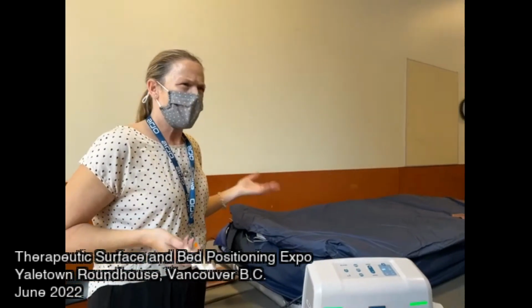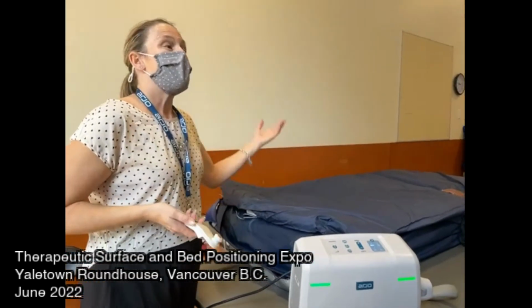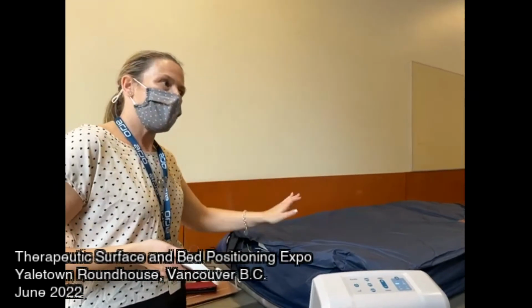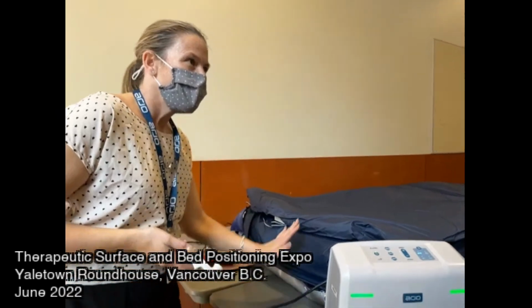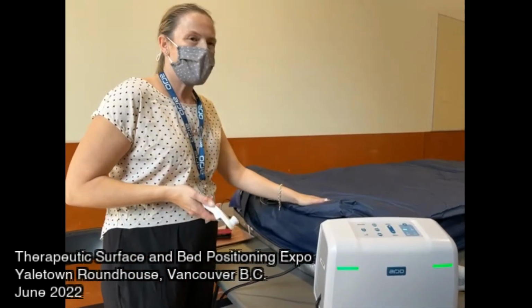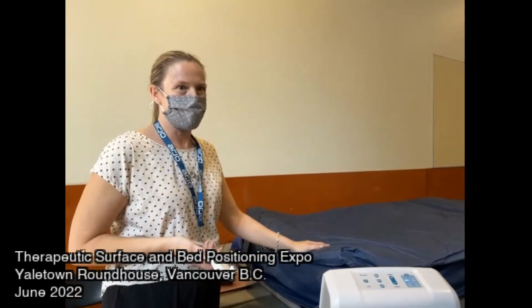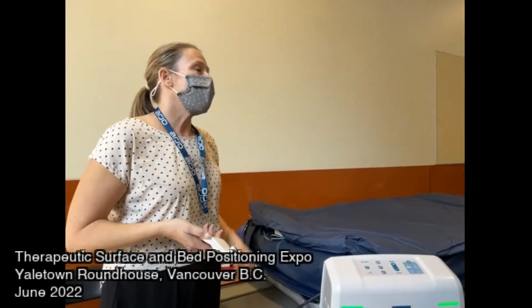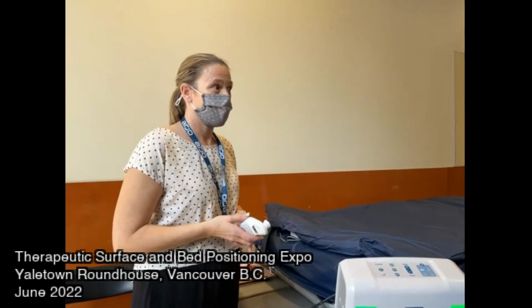How is that possible? It was the mattresses. They didn't have mattresses with a 10-degree heel slope. So every night the person was going to bed, the mattress was an issue. It's a great way to help detect all of those things before you can actually see them with the naked eye.